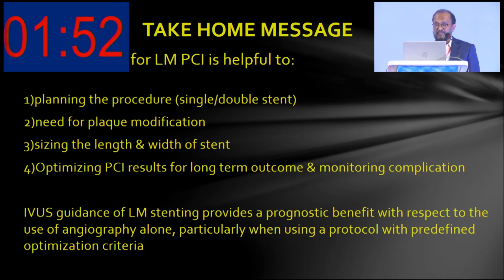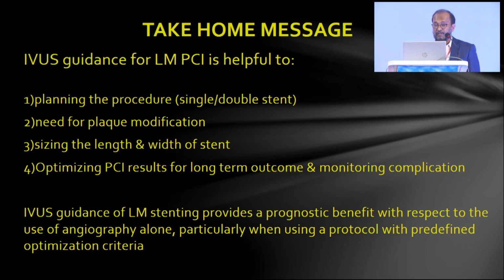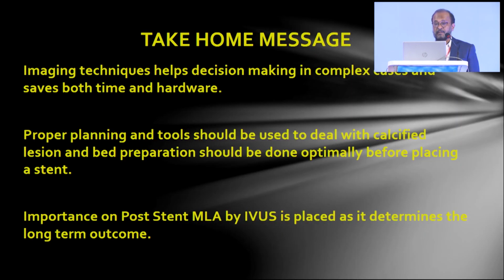IVUS guidance of left main stenting provides a prognostic benefit with respect to the use of angiography alone, particularly when using a protocol with predefined optimization criteria.